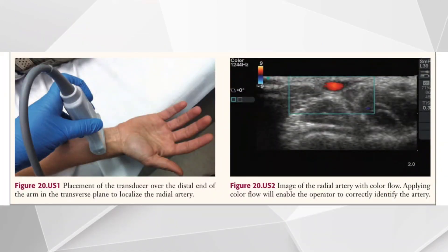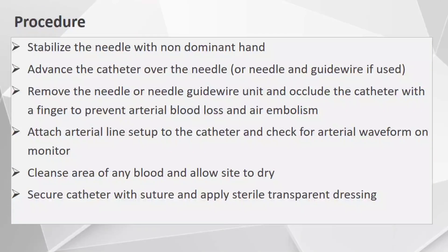To locate the radial artery under ultrasound guidance, place the probe over the distal forearm in the transverse plane to locate the radial artery. You can confirm it with the help of Doppler and see the color flow. Stabilize the needle with the non-dominant hand and advance the catheter over the needle, or needle and guide wire if used. Remove the needle or needle-guide wire unit and occlude the catheter with a finger to prevent arterial blood loss and air embolism. Attach the arterial line set to the catheter and check for arterial waveform on the monitor. Cleanse the area of any blood and allow the site to dry.